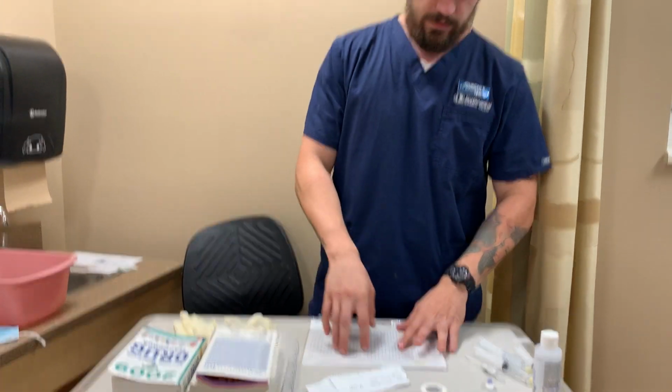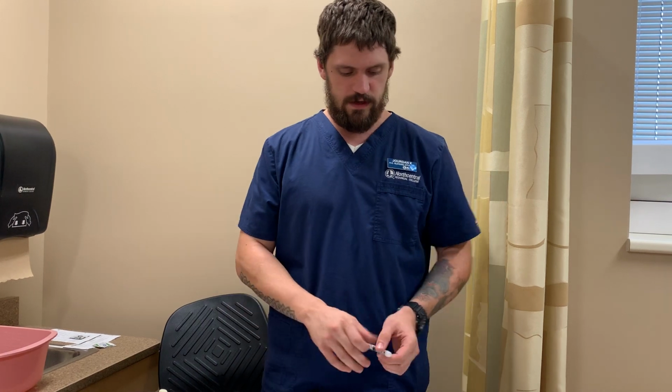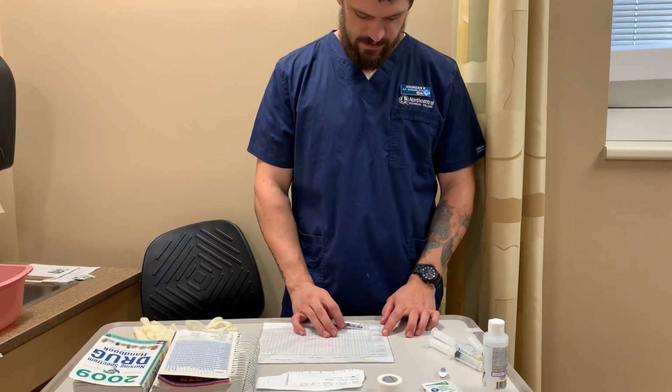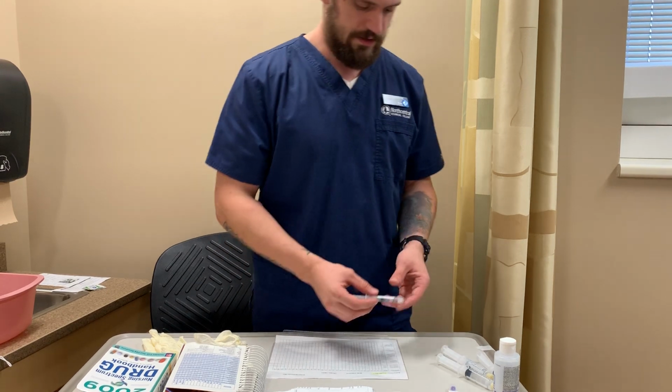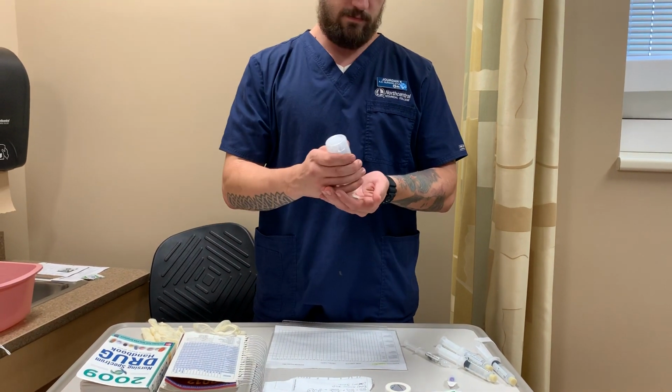All right, so we know that Ms. Doe needs this morphine. We have assessed the need for it, and we do think we are going to give it here. So, first thing I'm going to do is take a look at my med to make sure that I did pull the right med, and I have morphine, 10 milligrams per 2 milliliters. And we do have morphine here, 7 milligrams IV push every 3 hours. So we are going to give that. All right, so we're going to wash our hands.